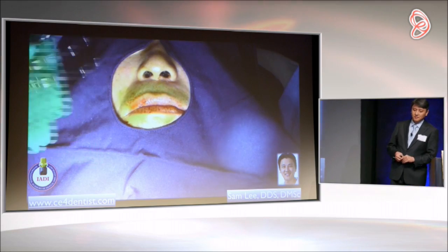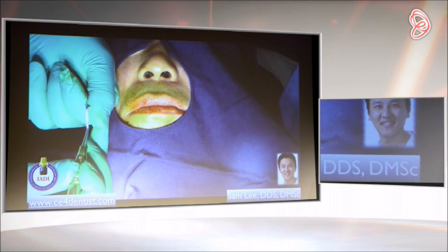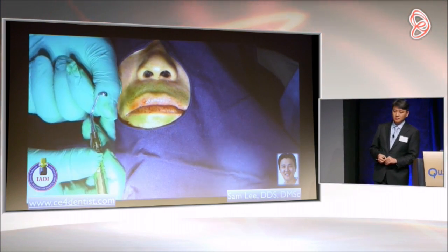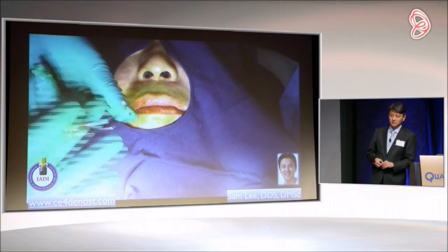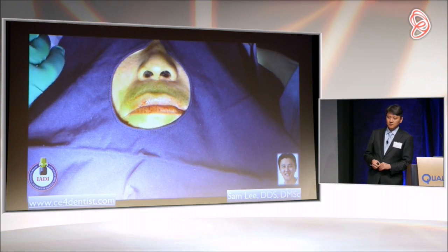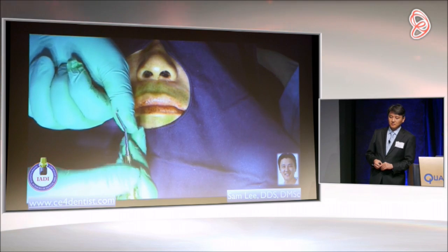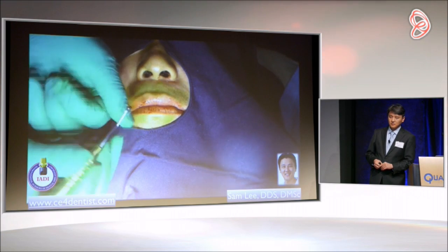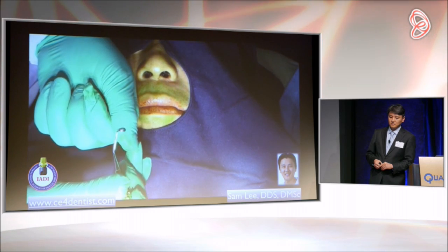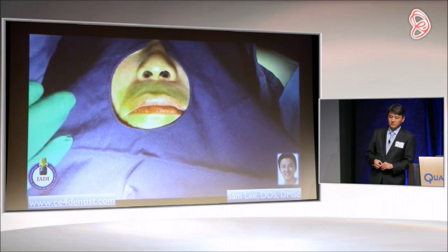And sometimes we do MIT technique to do bone graft. When you are going over the occlusal surface in the ridge, then you want to use this instrument. What do you mean over? So if this is buccal and lingual, this other instrument, in the most cervical area, yes, can go buccal, but going over the ridge is very difficult. So I made this instrument so that you can glide over the occlusal. Okay, got it. That way you can lift the gum vertically as well.